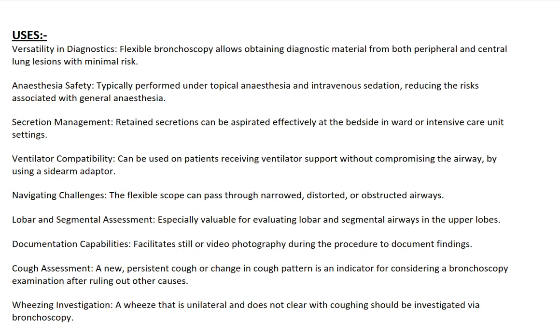4. Ventilator compatibility. Can be used on patients receiving ventilator support without compromising the airway by using a sidearm adapter. 5. Navigating challenges. The flexible scope can pass through narrowed, distorted, or obstructed airways. 6. Lobar and segmental assessment, especially valuable for evaluating lobar and segmental airways in the upper lobes. 7. Documentation capabilities. Facilitates still or video photography during the procedure to document findings.